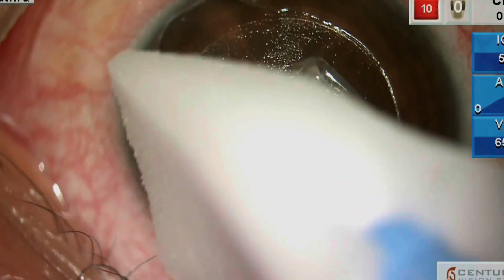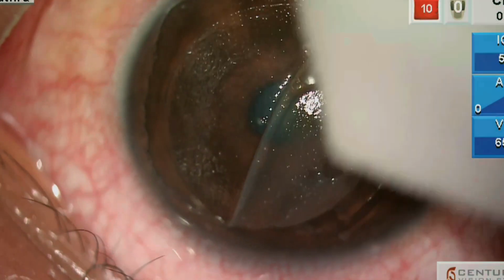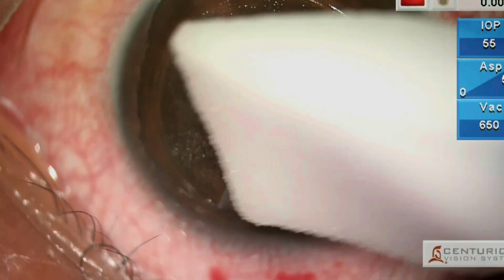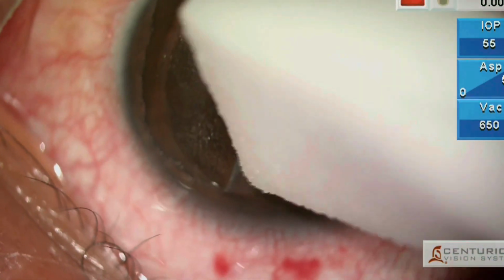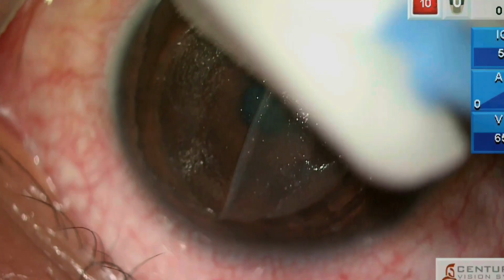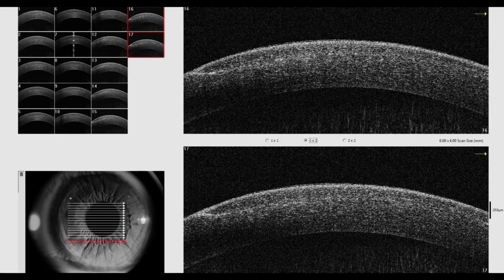Intraoperatively, mitomycin C was applied on the stromal bed and flap underside, where possibility of recurrence was highest. It is surgeon's prerogative to use mitomycin C in patients who may demand so, like in long-standing or persistent striae. Patient gained 6/12 vision post-operatively and went on to do well.